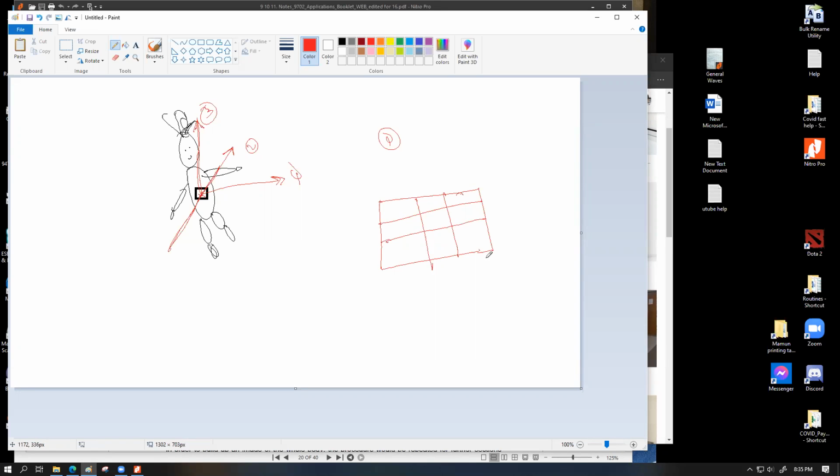But what I want you to understand is that if you're going for a 3 by 3 voxel box rather than a 2 by 2 voxel box, after doing the horizontal scan, you're going to get 3 sets of values. So you're going to have 3 values over here, and then you simply have to copy this thing into 3 by 3 columns. So you get these same numbers over here and get this whole thing. This will be your functional chart to begin with.